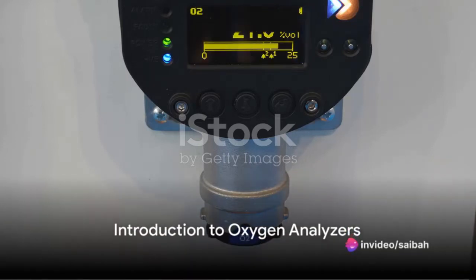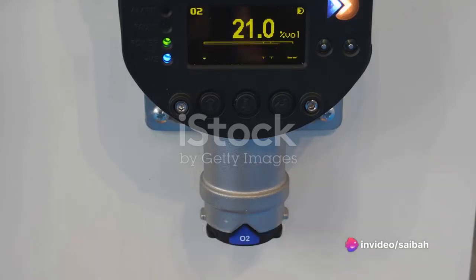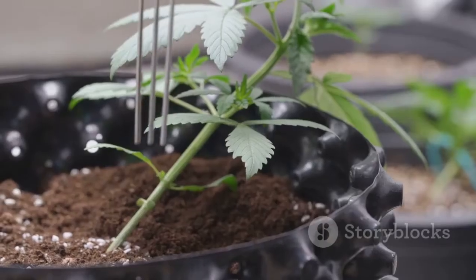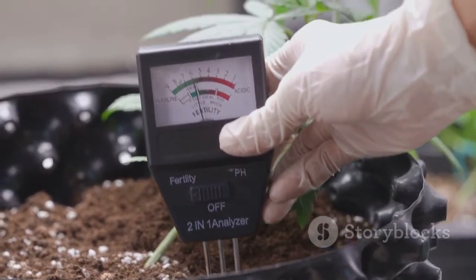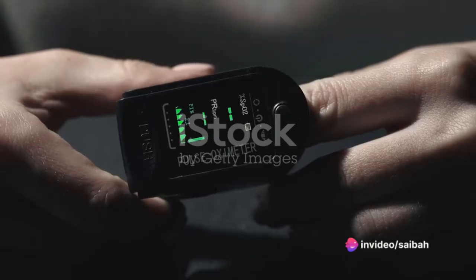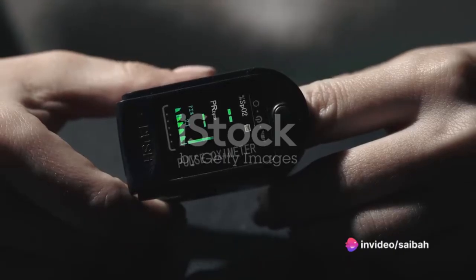Ever wondered how to calibrate an oxygen analyzer? Well, you're in the right place. Oxygen analyzers are crucial tools used across a wide range of industries, from healthcare to environmental monitoring, and even in the production of high-quality steel. They offer a precise measurement of oxygen levels, ensuring safe and efficient operations in various settings.